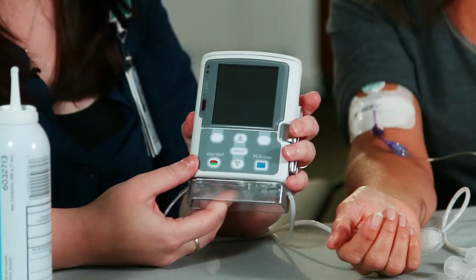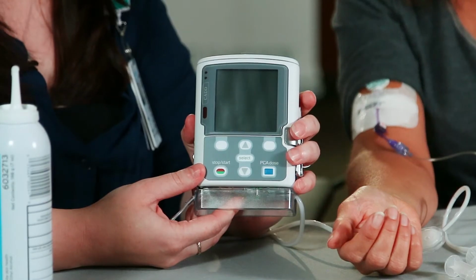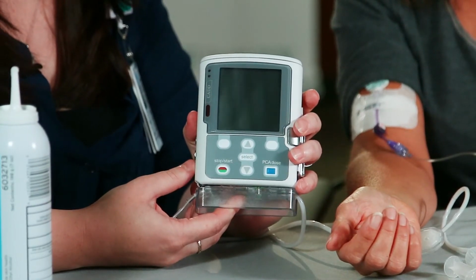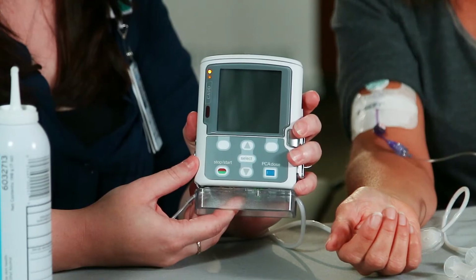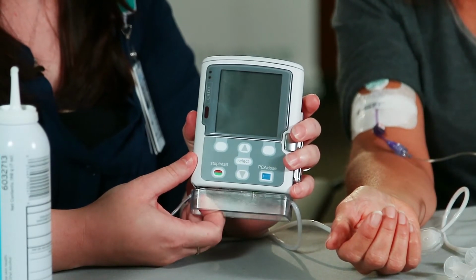So in this chapter, we will be discussing stopping your TPN and flushing your PICC line. Once your TPN has completed, you will hear audible beeps and a message will display on your pump screen indicating that the infusion is complete. You want to push the soft key to acknowledge. If you are unable to disconnect right away from your TPN, the pump will automatically go into what's called a keep vein open rate. This delivers a small amount of medication to ensure that your PICC line stays open.